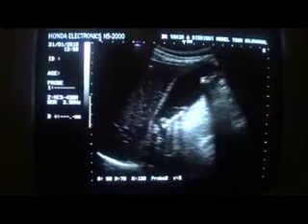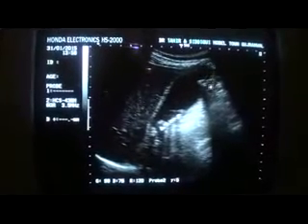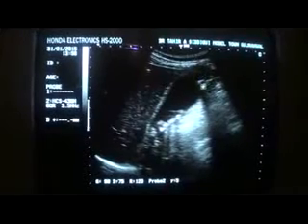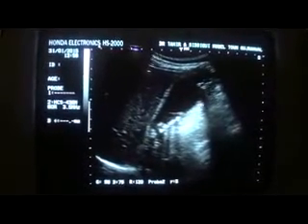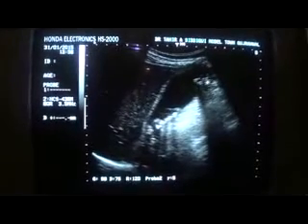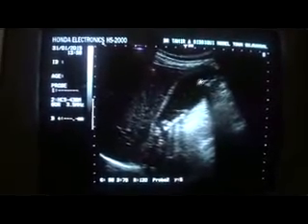As you can see, there are calculi in the fundal region. This is 1, 2 and 3 giving posterior shadow. Now we were missing this. Suppose these calculi were absent, and only these calculi were present in any other given patient, then you would have missed this and given a normal report.